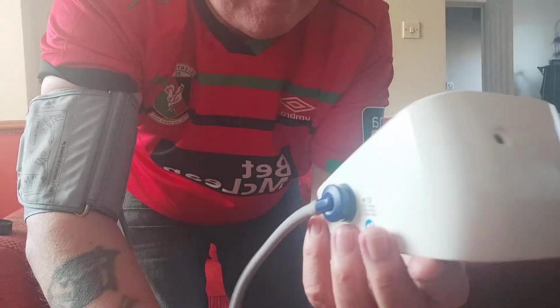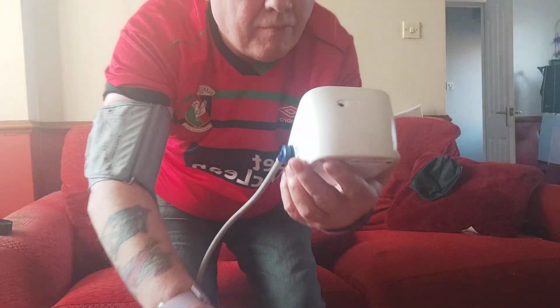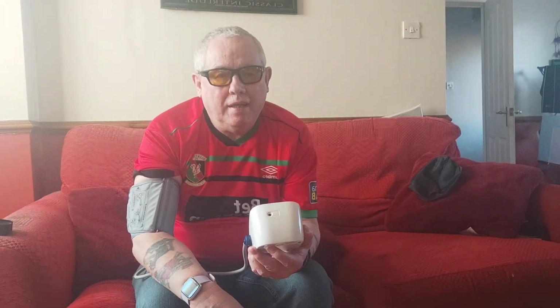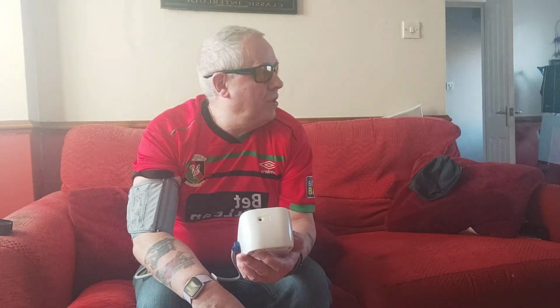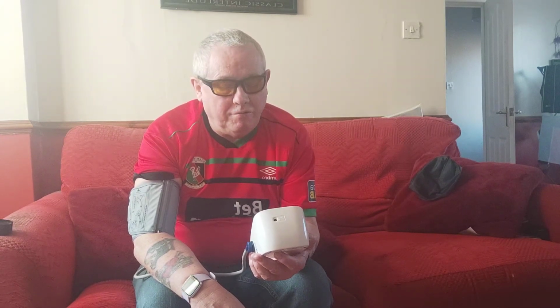146/94, and my heart rate is still good at 76. 146/94 is not that bad when I've just been out of bed, and I've only just taken my tablets. I would say I'm actually dehydrated because I'm only about an hour or so out of bed. So I need to get a lot of water in me. I need to walk about, get a bit of exercise, get the blood flowing.